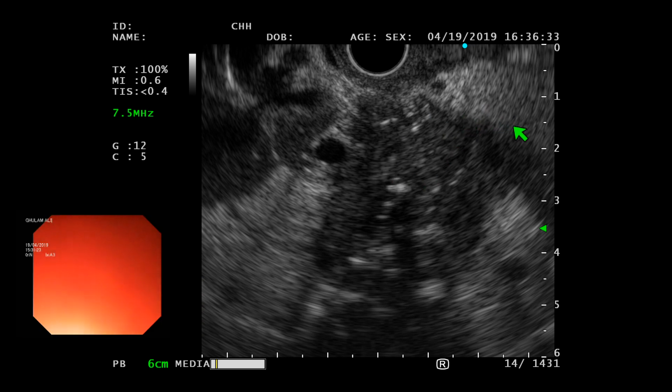Khalid, you can appreciate the necrosis. Spiculations, how do you differentiate from... Here, this one, this edema in there, into the wall, here. This one, this roughness, right here, right here, right here. This is necrosis with maybe a little bit preserved parenchyma, but with edema. All these are features of acute pancreatitis. There is a lot of inflammation here too, in the duodenal wall, and that also is all a feature of acute pancreatitis.